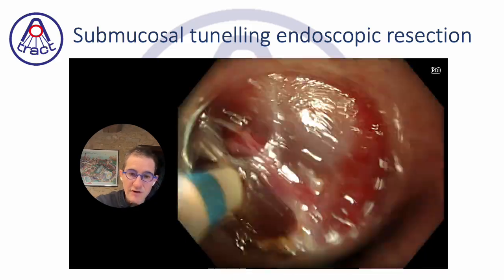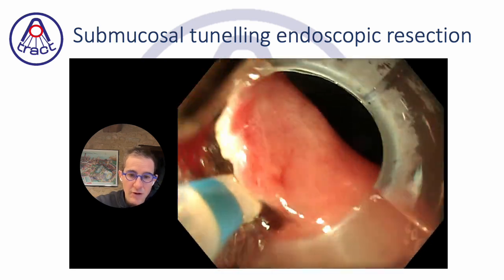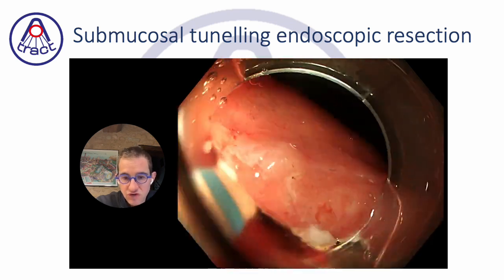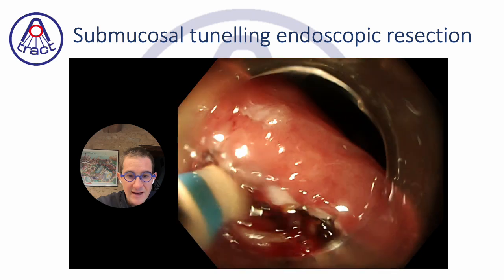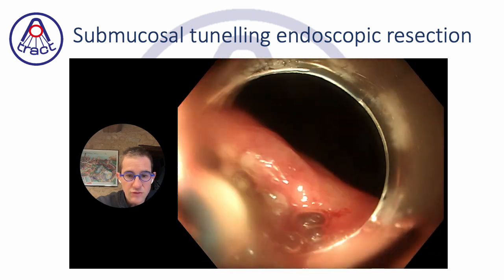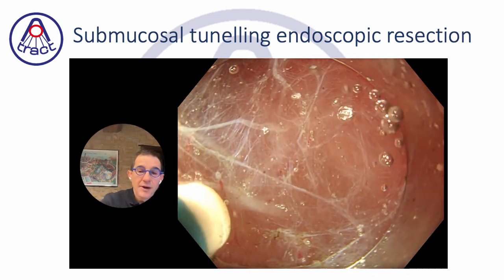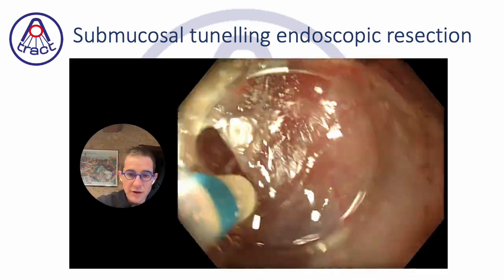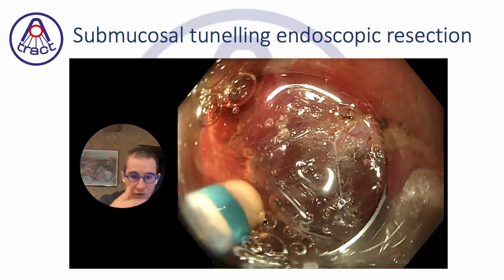When you have a bleeding that comes from a blind area, try to do a little more tunneling, or dissection, or incision to open the space a little more in order to at least see where the bleeding comes from, and then later to be able to coagulate with exposure if possible, blindly if unfortunately it's almost impossible to see the point, because the edge of your incision is always falling down.